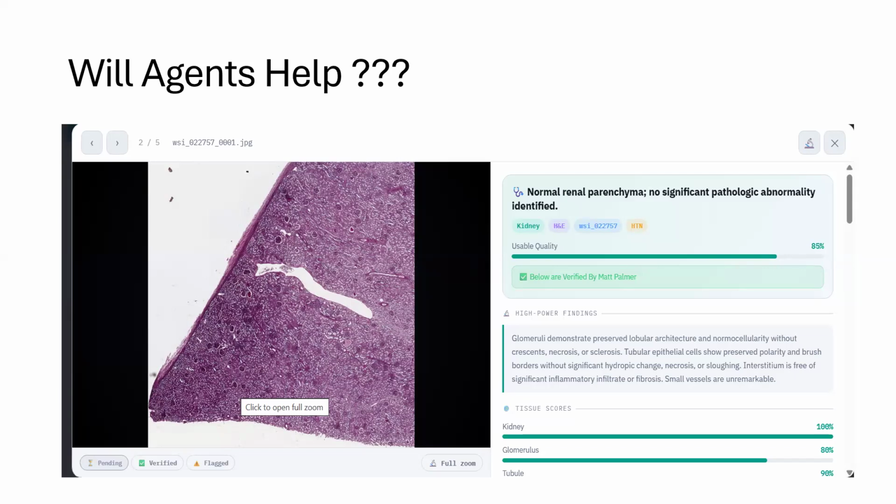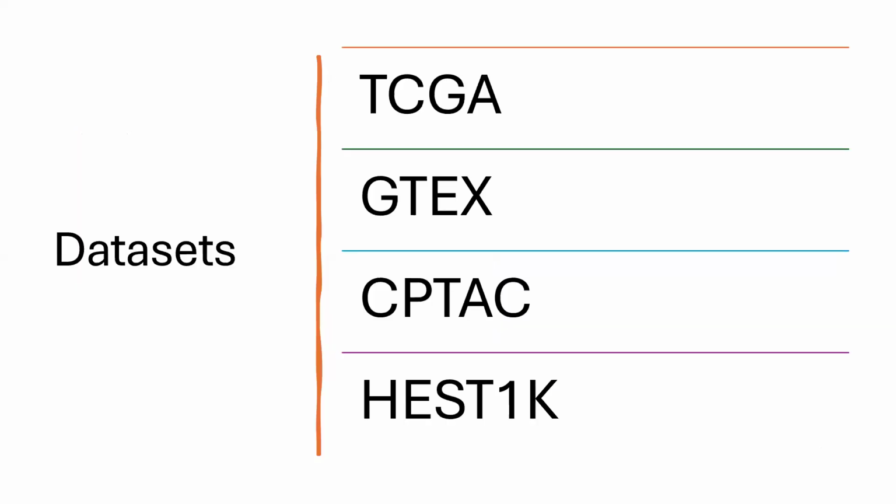So we took all the images, fed them to an open-source model like Kimi, and it predicts something. We can do quality checking of whether the biopsy is good or bad based on its prediction, pass that to a pathologist, and finalize whether we can use it. General language models are also good at these things, but the inherent complexity can confuse them. So this is one of the ideas.